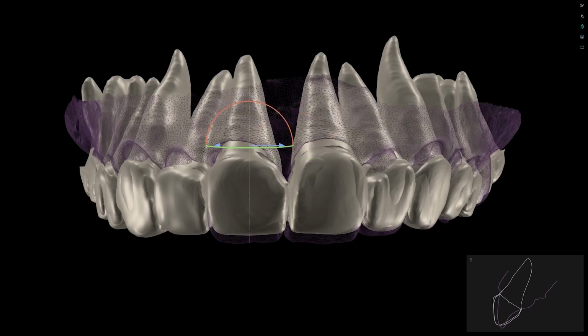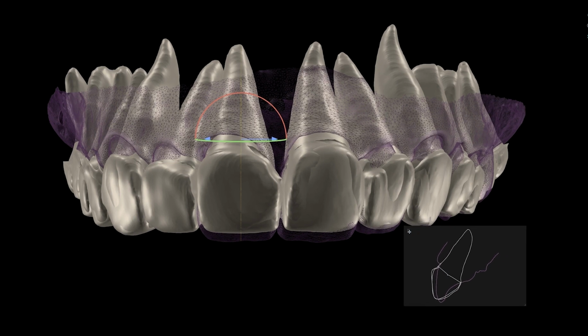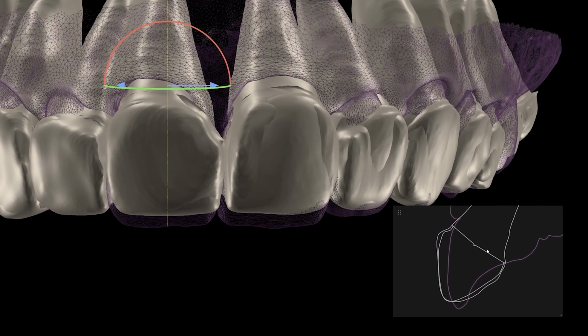Now these two combined, the fact that both the maxilla is going in and the structures are also in a more palatal position, can lead to huge discrepancies between where you place the shape and where you can in the near future realistically be placing the prep. And this can result in a lot of frustration in the design process, because essentially if you disregard these factors, you are designing something that can never be achieved in reality.